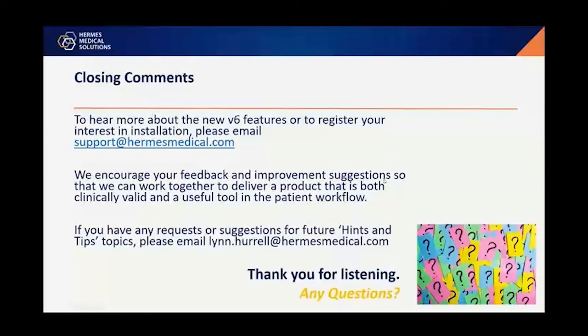Thank you. Great, thanks very much, Lynn. It's a very comprehensive overview there of the changes to hybrid viewer.